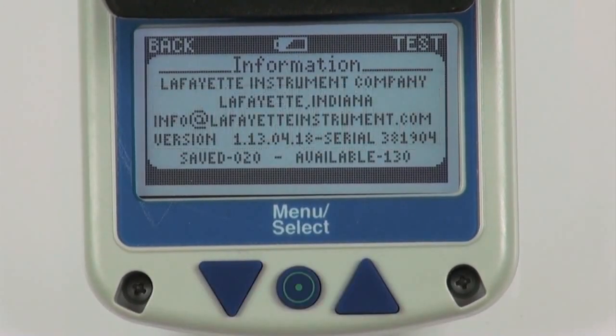The information menu screen provides a contact email and various information about the MMT.